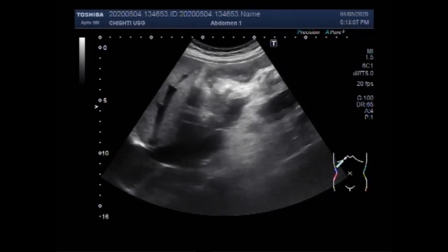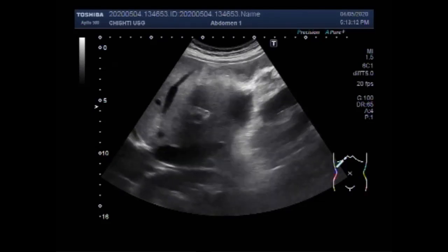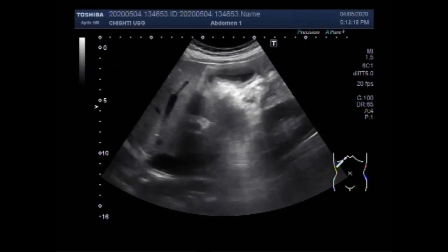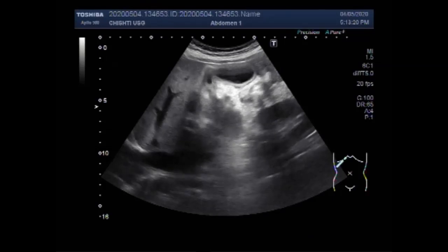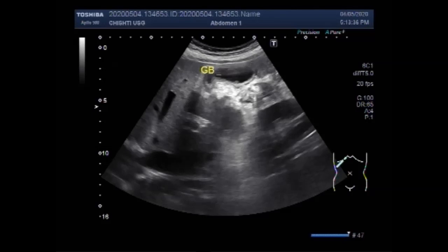Now you can see a small amount of sludge is seen in the gallbladder. Now this is the gallbladder. This is the sludge you can see.